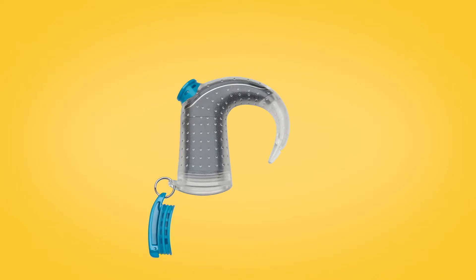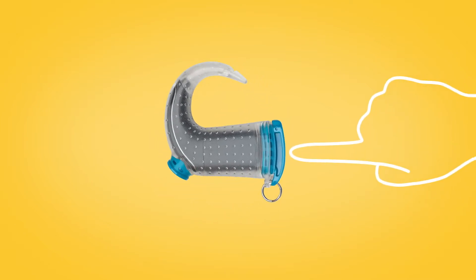Once your sound processor is inside, insert the plug into the base of Aqua Plus. To make a good seal, push the plug in as far as it will go.